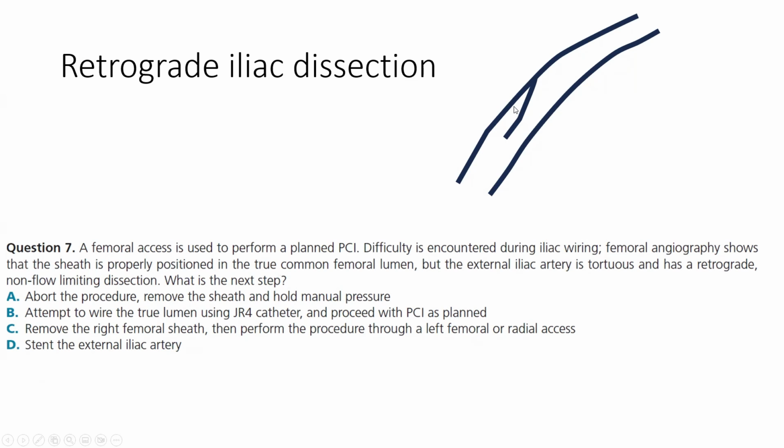That's why, when you're doing your femoral angiography, one, make sure you have a pressure waveform through your sheath before you inject. And number two, don't use a stiff sheath to inject. Some micropuncture sheaths are very stiff in some brands. Do not use those to do your femoral angiography. It has to be a soft micropuncture or a soft sheath.